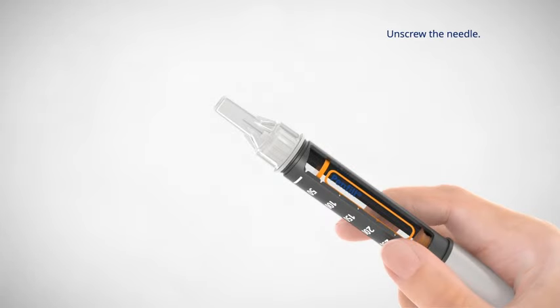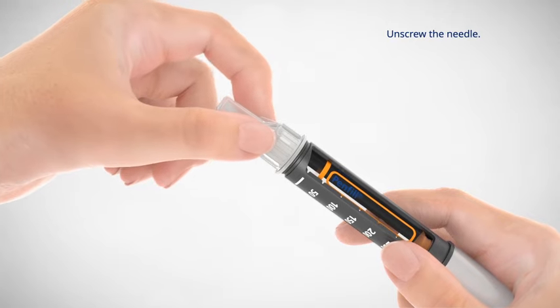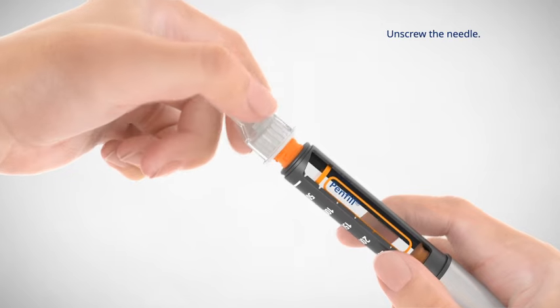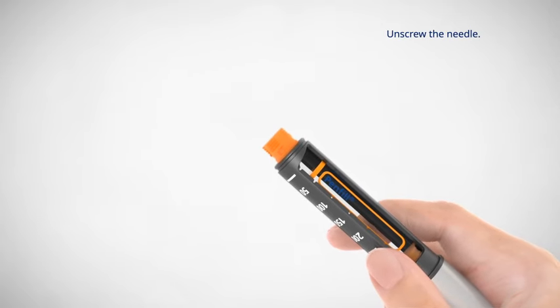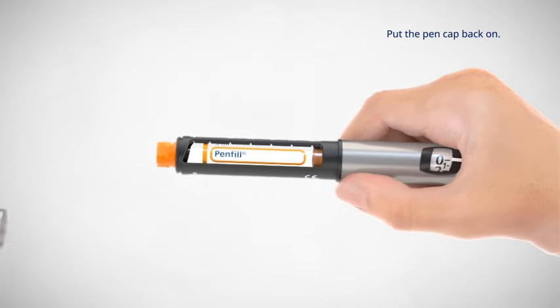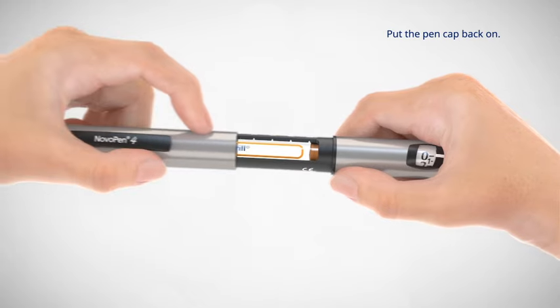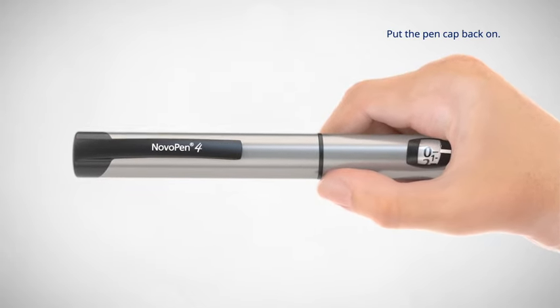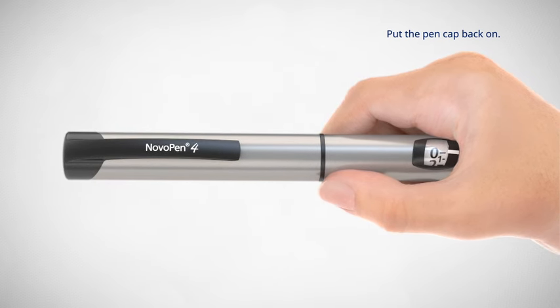Always hold the black cartridge holder when you unscrew the needle. Otherwise, you may twist your pen apart. If this happens, twist the pen together again. Dispose of the needle carefully. Put the pen cap back on and store NovoPen 4 according to the storage instructions in the pen fill cartridge leaflet that comes with the pen fill cartridge package.